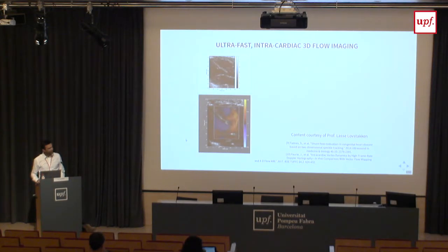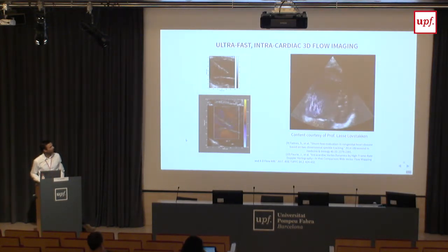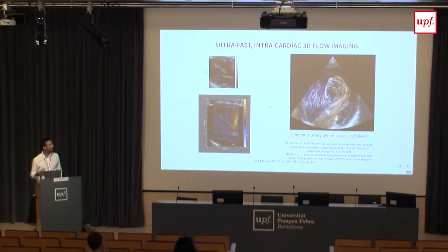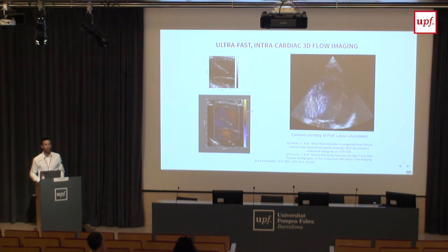And you can even go to the ventricle and get really highly defined vortices and basically dynamic images of intracardiac flows. And this is on a real subject, a pediatric subject in the heart. And I think it's difficult to think this is going to get cooler than this, but it will, because now the research is going towards 3D imaging of vortices. This is not going to be the solution for everything. Ultrasound has many limitations, particularly for artifacts that you cannot get rid of, such as shadowing, view-dependent artifacts, and so on. But there is lots coming up, and it's very promising as a measurement tool.